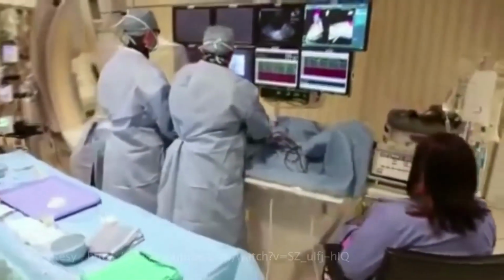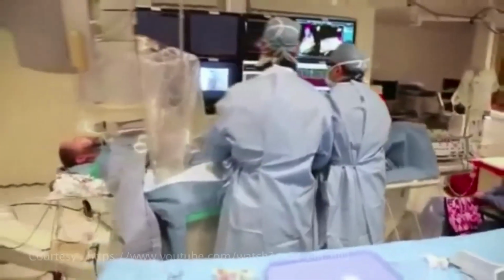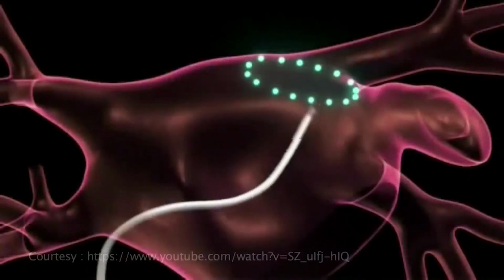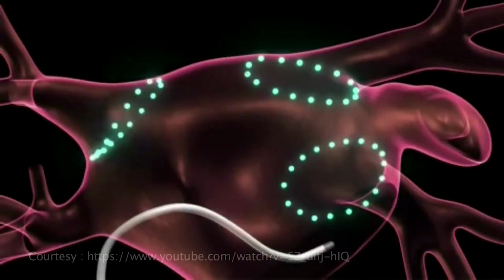And that tends to serve as the initial spark that sets people off into atrial fibrillation, shorting out the entire chamber. Medicines, when we use them as an approach to the management of atrial fibrillation, try to calm down that irritability. When the medicines are ineffective, and we're going to take the patient to the next level of our therapeutic approach and go for an ablation procedure, what we're doing is burning or ablating the tissue around those veins to ultimately turn that tissue over into scar.